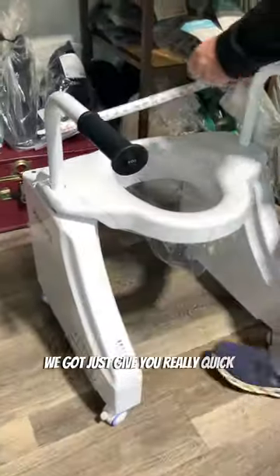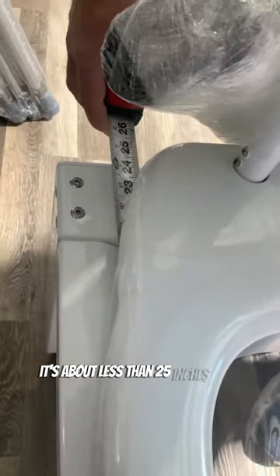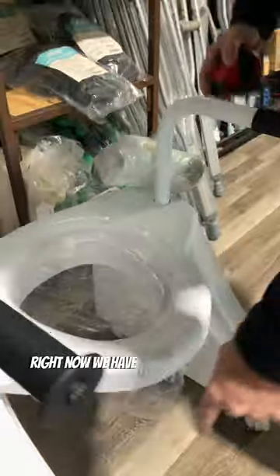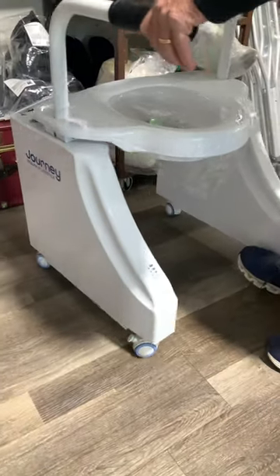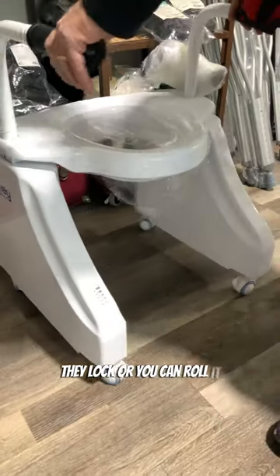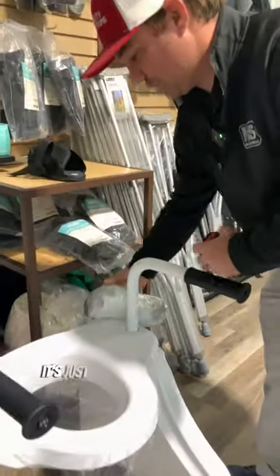Let me give you really quick specs. The overall width of the unit is about less than 25 inches. Right now we have it set up on caster wheels — you should have locking casters. They lock or you can roll it. And this is the other set of feet, which looks like your standard feet.